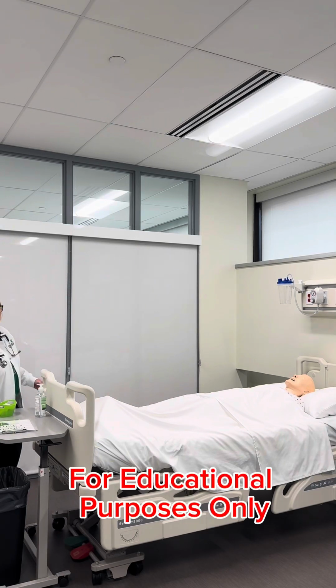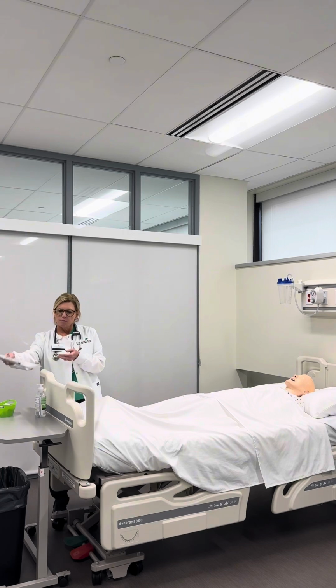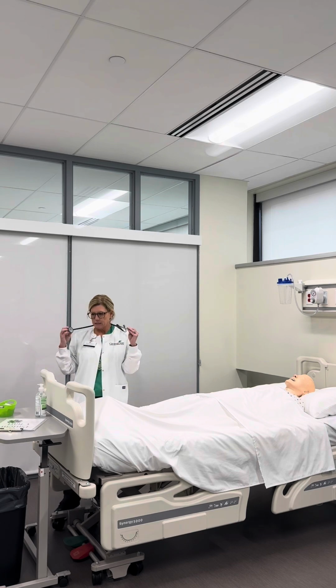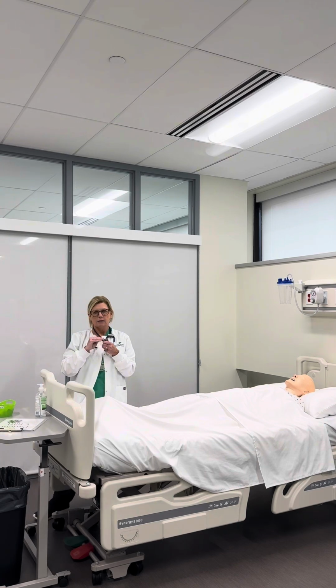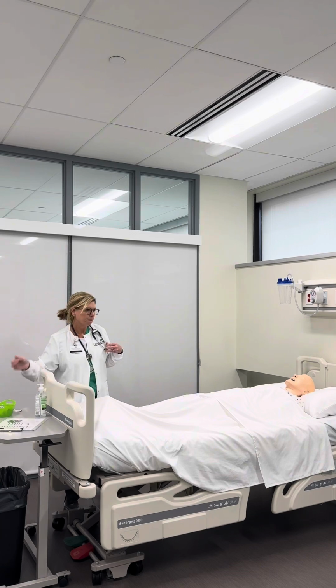Open the door, check the chart, perform my hand hygiene, make sure I have my supplies. I've got my stethoscope. I want to clean the diaphragm and the earpieces of my stethoscope.